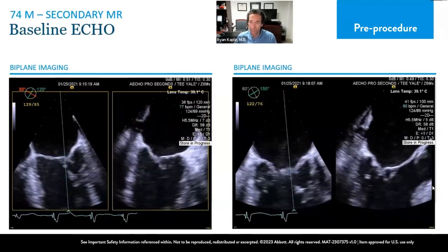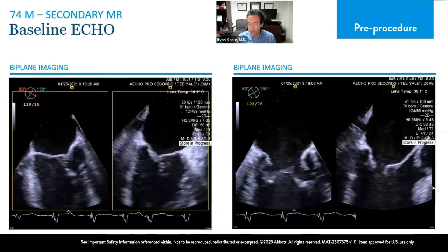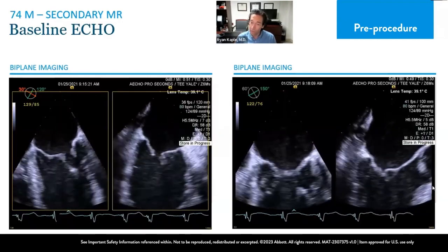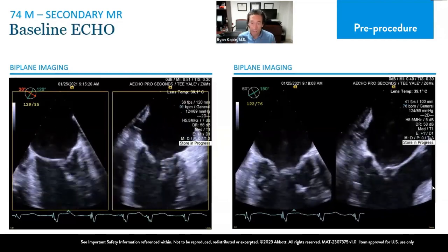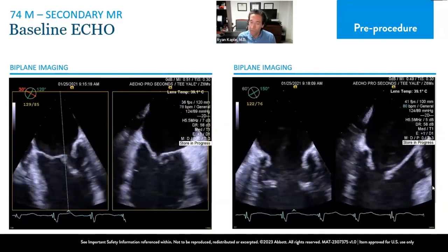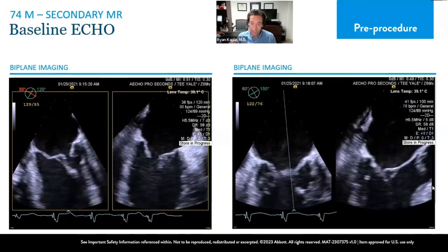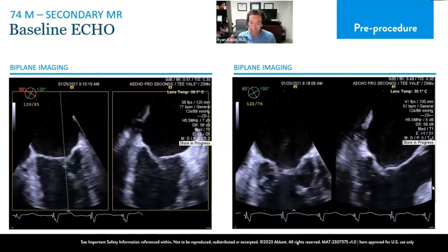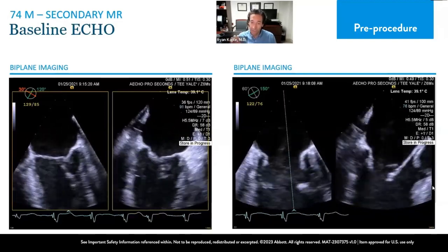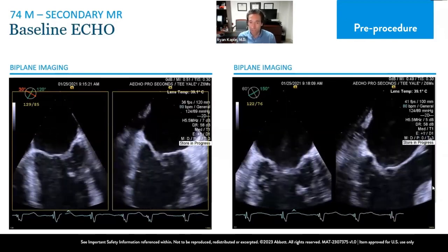There's cords that insert into the mid body of the leaflet and they're restricted in their coaptation because of these cords. So not just the cords that attach to the tip, but certainly into the body of the leaflet can impact the leaflet function. But if I'm going to be grasping in this area, I feel that the working length of the leaflet is really the tip to where that cord inserts into the mid portion of the leaflet. Because if you're grasping here, the tip of your arm may not be able to get past that part of the leaflet in terms of leaflet insertion.